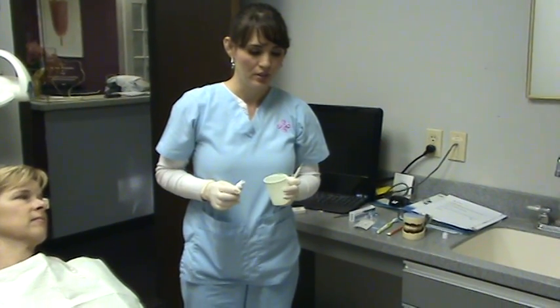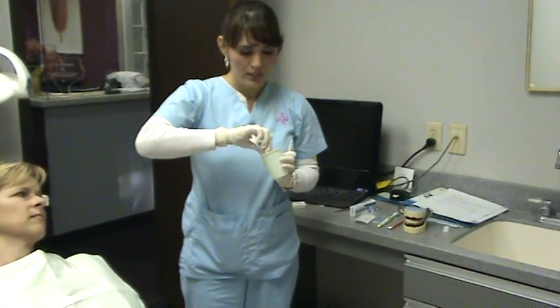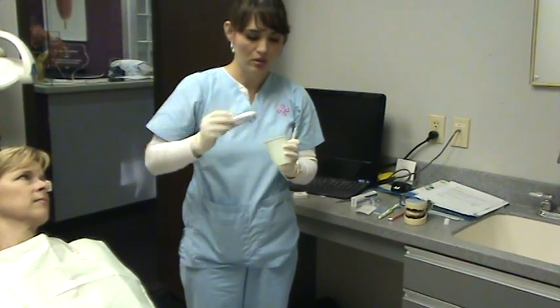Hi, I'm Sharon from Dr. Hamilton's office and I'm going to demonstrate how to use a proxy brush. First, you get toothpaste and put it in a cup. You can also use Pepto-Bismol caps or any type of small cup.